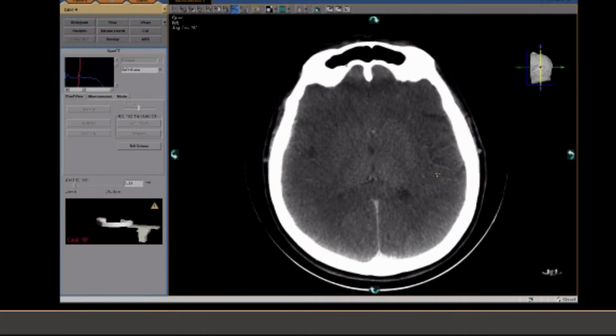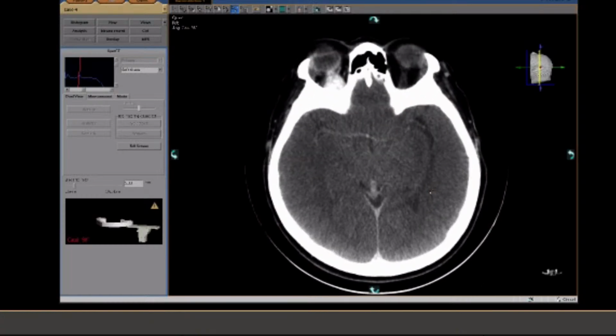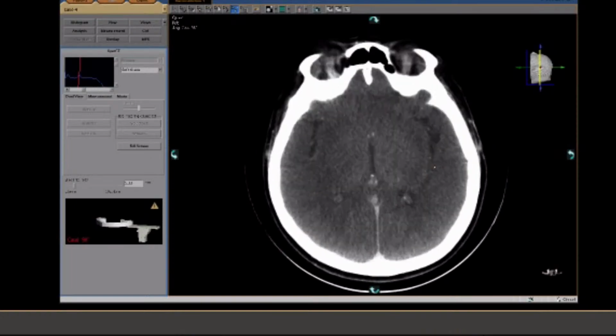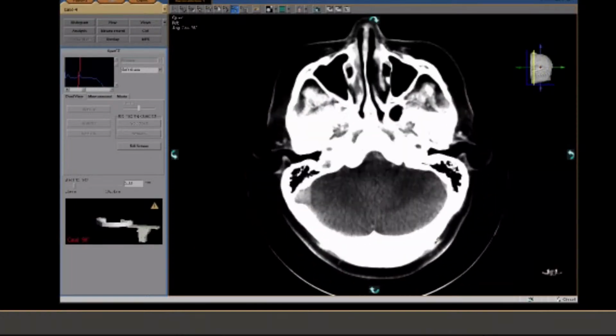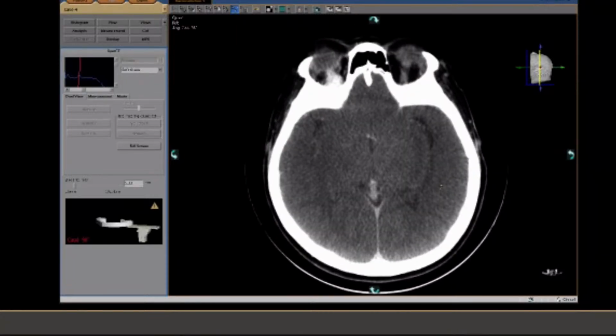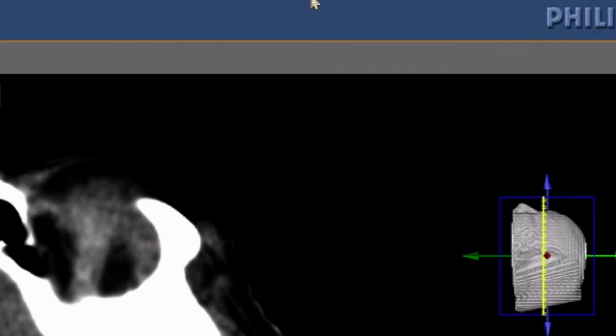The colleagues, CT is ready. Now you can see the pipeline distally, and the brain is normal. I am now finishing the audio stream, and David will continue the video stream. And in 8 minutes there will be control angio, and if the stent is clear and the brain is okay, then we will finish.